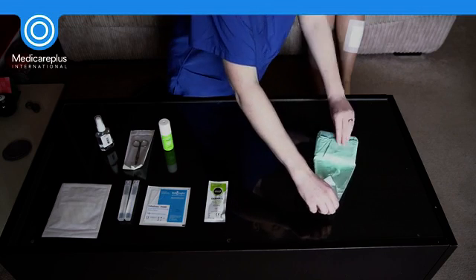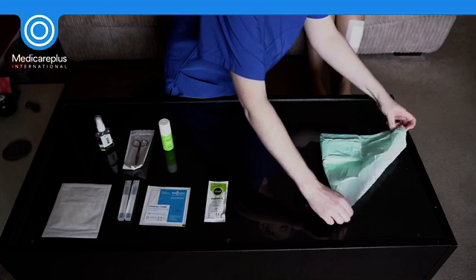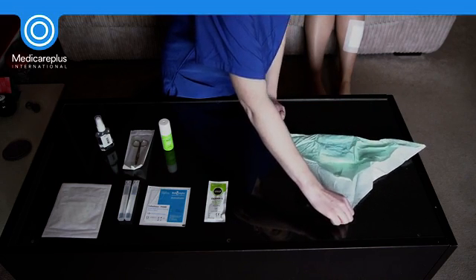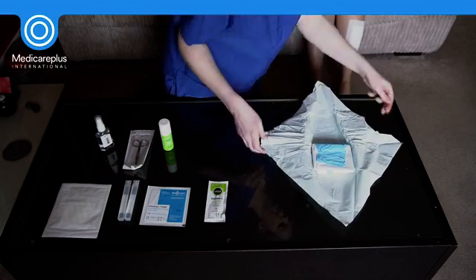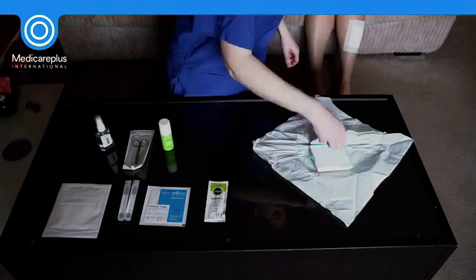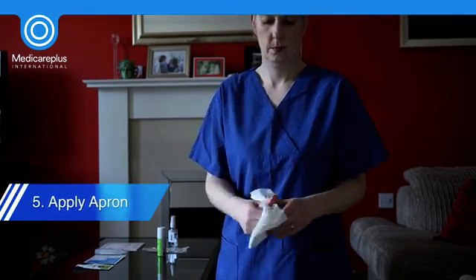Your dressing pack can now be opened onto the working surface and spread out using the corners only, to prevent contamination of the main part of the sterile field with your hands. Position your sterile field as close to you as possible. You can now remove the apron from the dressing pack and put it on.